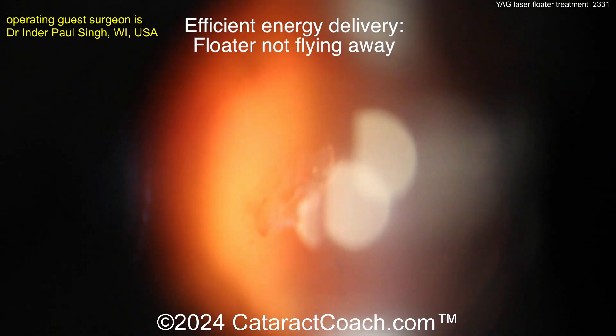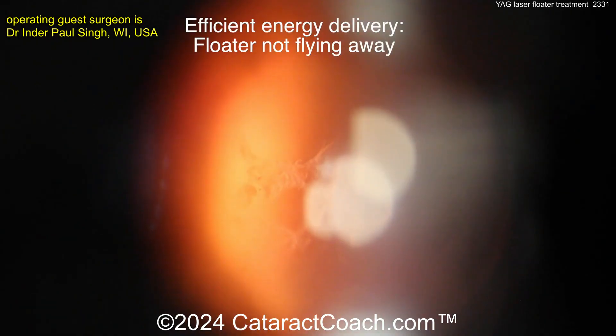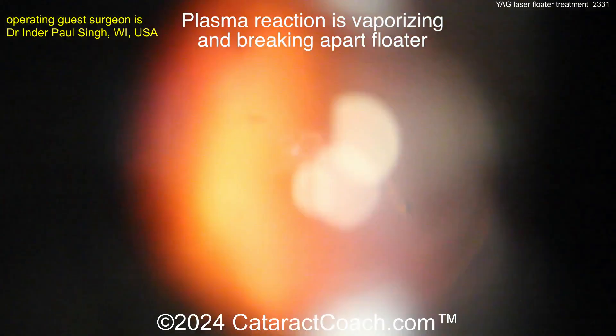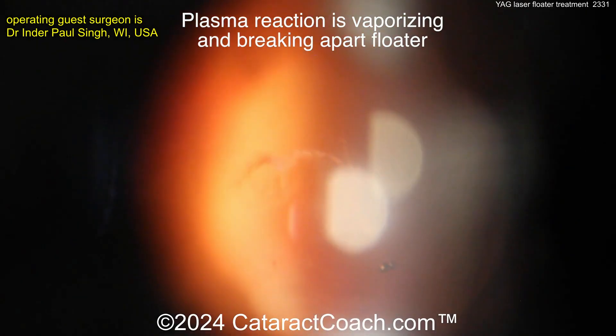Coaxial illumination allows the red reflex and visualization of the retina because the aiming beam, the laser, the illumination tower, and the oculars are all on the same optical pathway, giving us the needed spatial context for this procedure to be done safely and efficaciously. You also see the floater is being vaporized — it is not being moved away or bounced around. We are mechanically breaking it apart as well as vaporizing it, because there is a plasma reaction. It's also a non-linear rise in energy as you increase the laser energy — therefore increasing from five to ten millijoules does not double the amount of energy dispersion. The opacity is staying very close to where the plasma energy is being fired, not scattering far away.